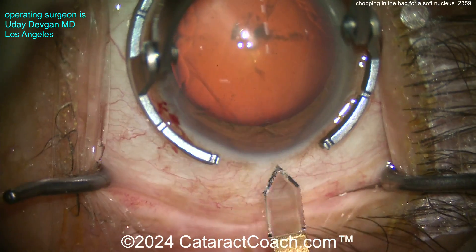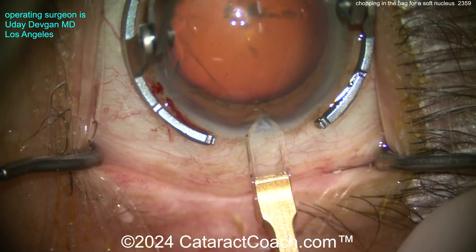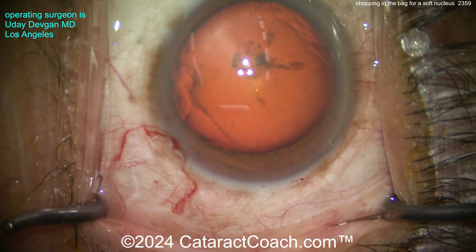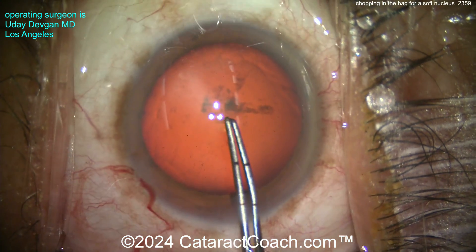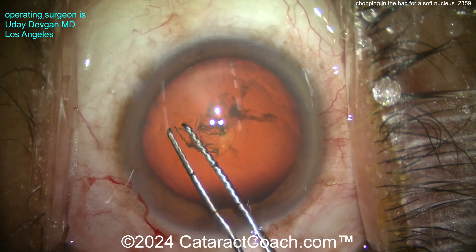Now here comes the main incision — going to use a diamond keratome to create a nice single-plane incision temporally. I like to barely nick those limbal vessels. This is a complete cataract case done at our Beverly Hills surgery center very recently, pretty much a routine case, and we're going to end up with a slightly more conservative-sized capsulorrhexis.